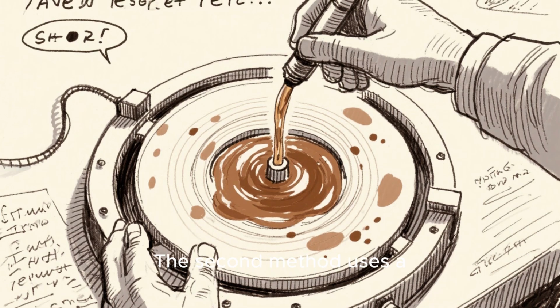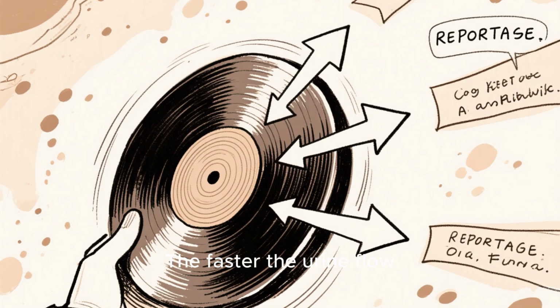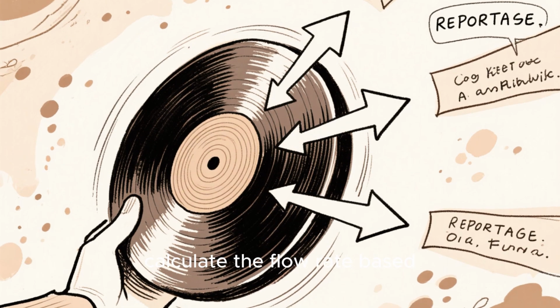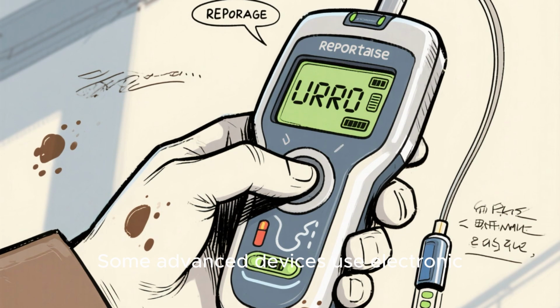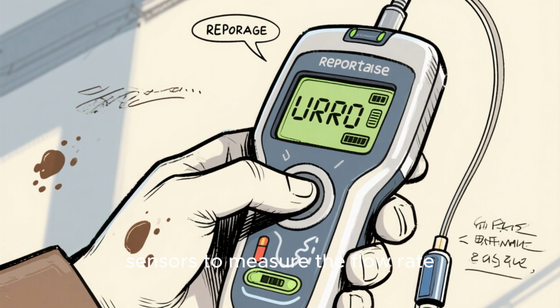The second method uses a rotating disc that spins as urine hits it. The faster the urine flow, the faster the disc rotates, so the device can calculate the flow rate based on the rotation speed. Some advanced devices use electronic flow sensors like ultrasonic or capacitance sensors to measure the flow rate.